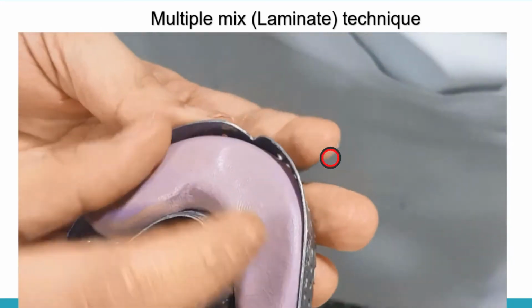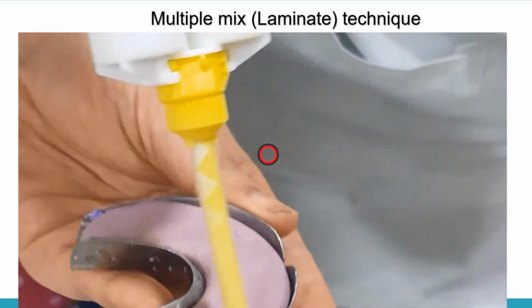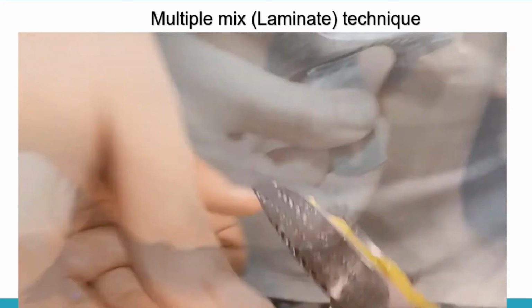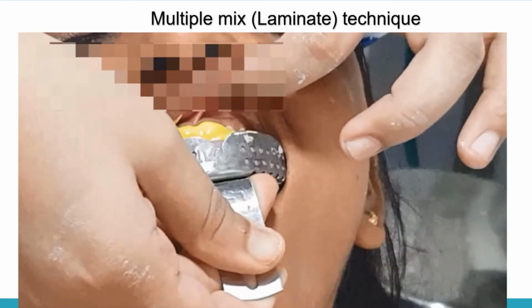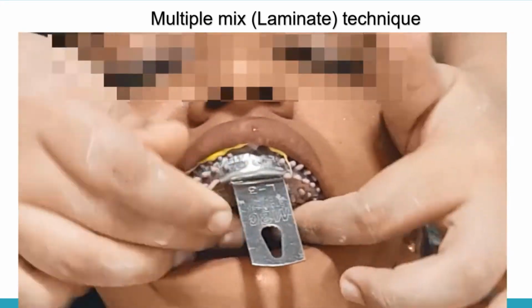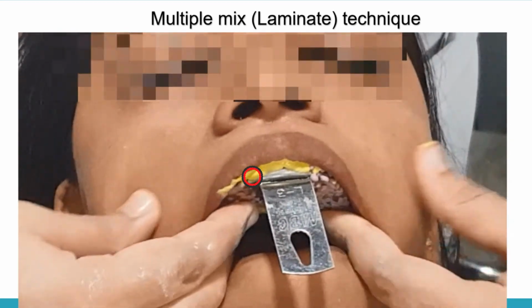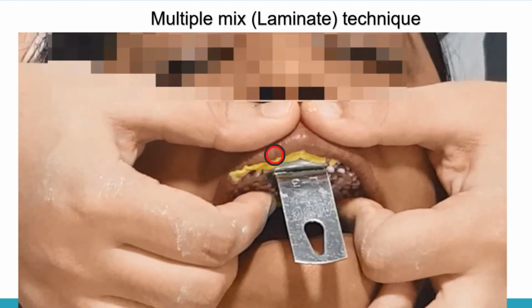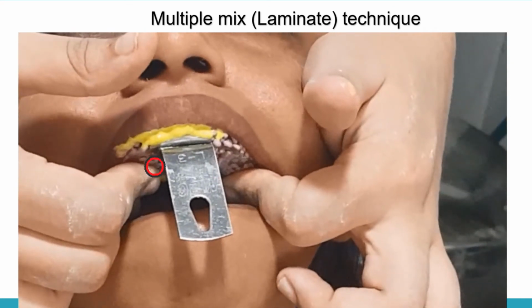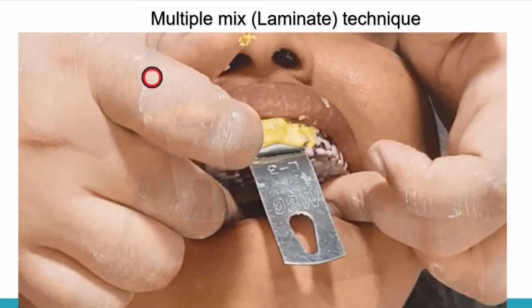Then we take the putty on the tray. We make a depression and we apply a little bit of light body on it. And then we put it inside the patient's mouth and we make the impression. So here we can see this is a one stage method. We are taking the light body impression and the putty impression simultaneously. That is why we call it the laminate technique. Now this approach has a risk of displacing too much wash material by the putty because we are applying a lot of force.